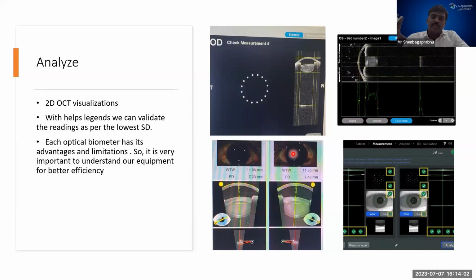It is because of interference from eyelashes, which is clearly visible in the OCT itself. So the keratometer reading from this measurement will not be good. This can be easily understood, because the mistake we made was that we didn't instruct the patient to open wide while taking the measurements.